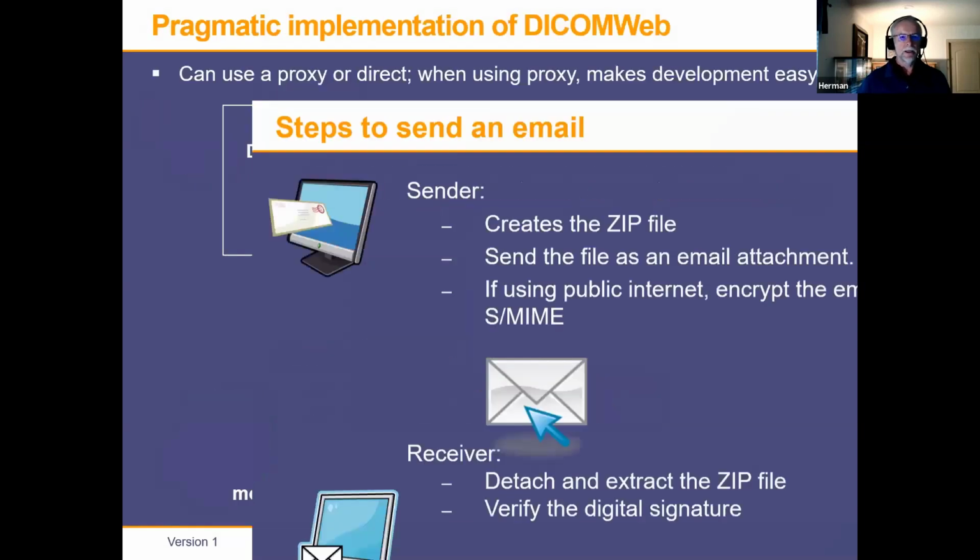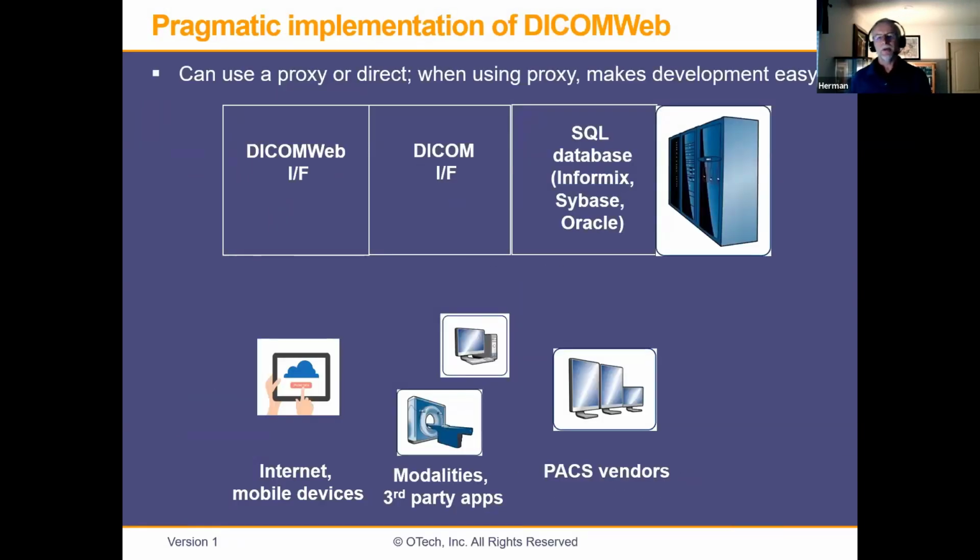Now let's talk about how we implement DICOMweb. Let's say a developer or a PACS vendor has an existing PACS system. The existing PACS system typically has a SQL interface, depending on the database they're using, Informix, Sybase, Oracle, whatever it is. And so the PACS vendors, when they connect their own workstations, do a SQL select statement to give, for example, a worklist. That is how most of the PACS vendors currently talk to their own database backend.